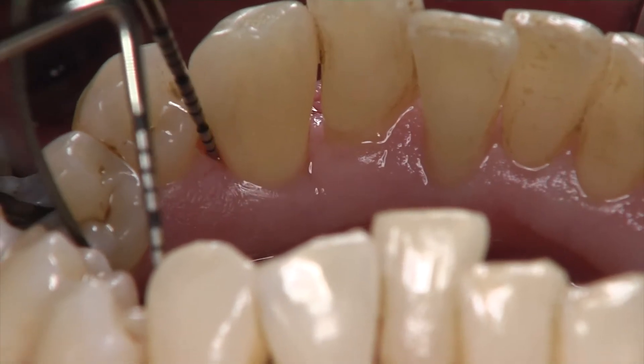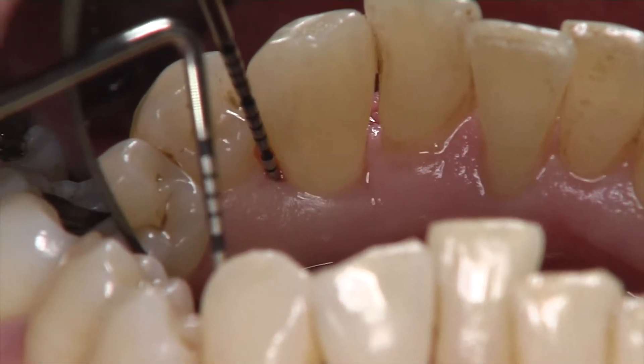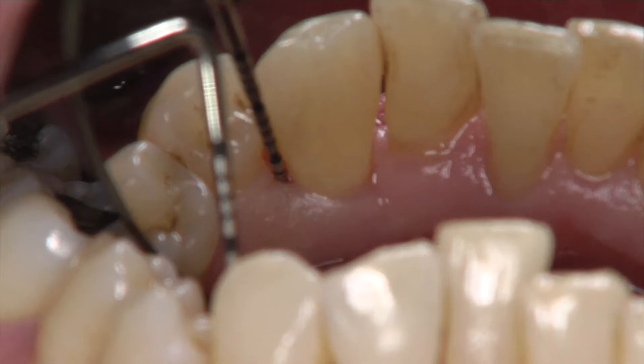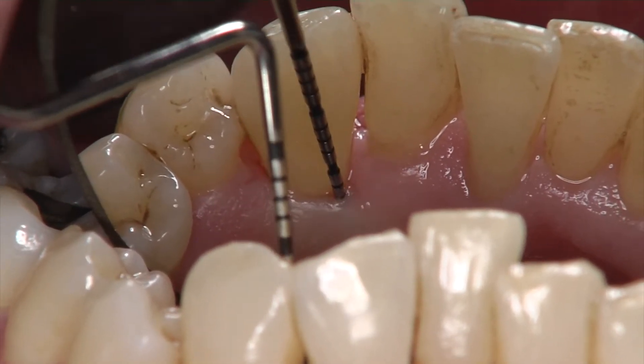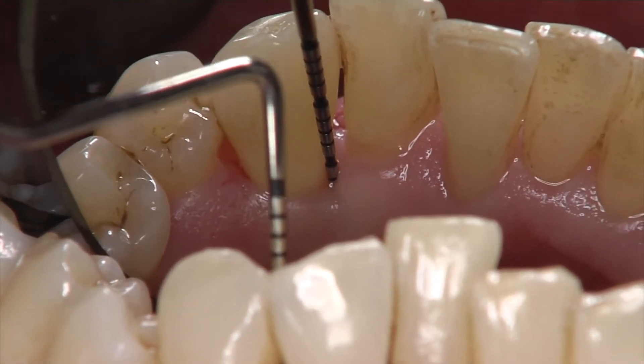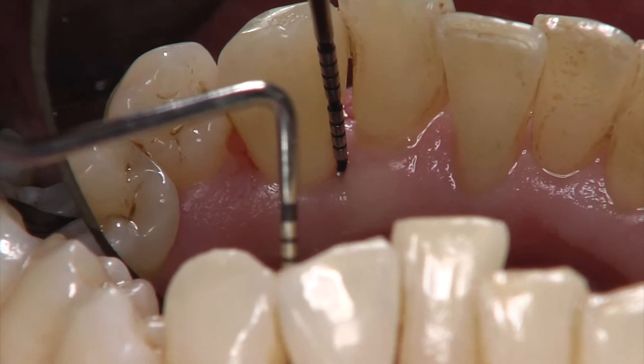Careful bone sounding is carried out to diagnose the extension of the defect, which for this particular defect extends to the buccal and lingual area.